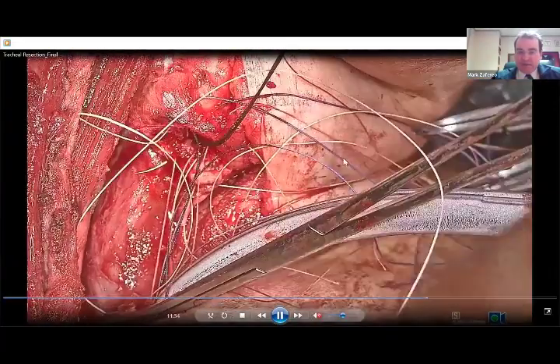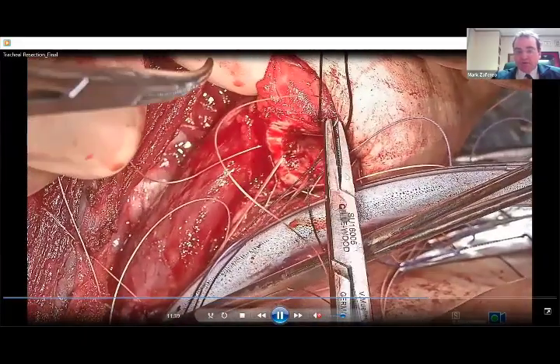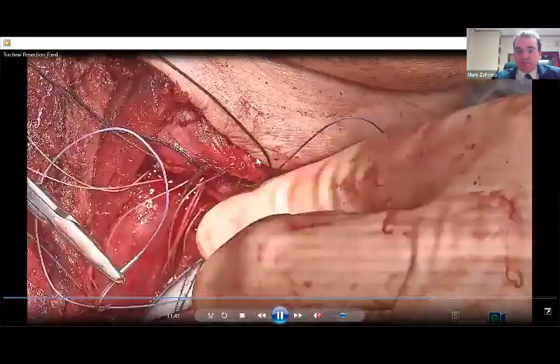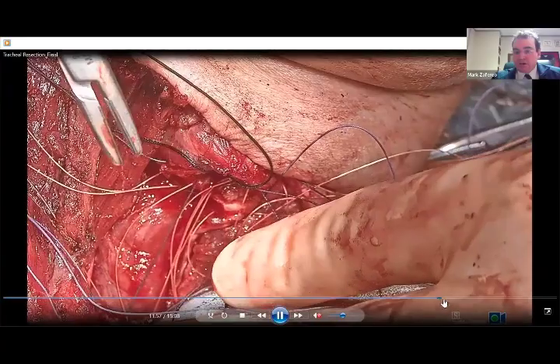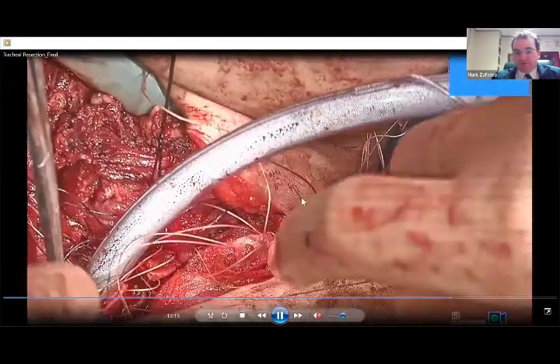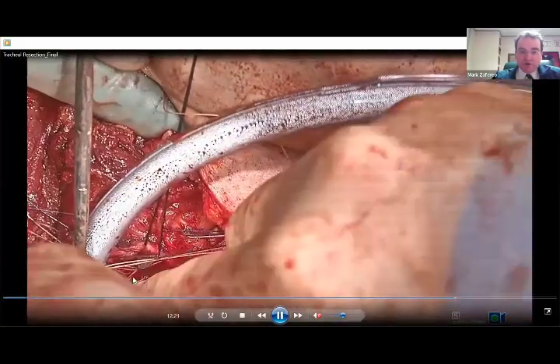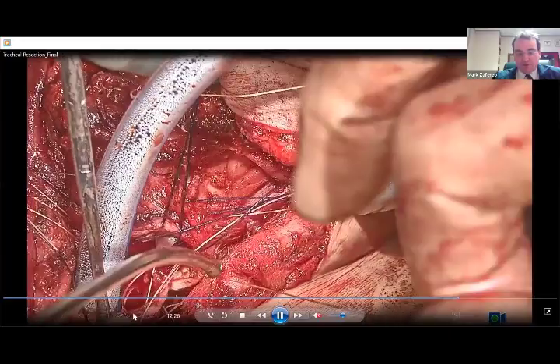I think it's very important to keep track of all these sutures. You have to have a specific technique for doing that. Usually you keep the mosquitoes on a straight clamp and you keep them in order so that when you sew them in, you can sew them in from posterior to anterior. I'll skip ahead a little bit. So this is the start of sewing it in posterior to anterior. You can start on the right or the left. On the left side, you're going counterclockwise, on the right, clockwise, from posterior to anterior.